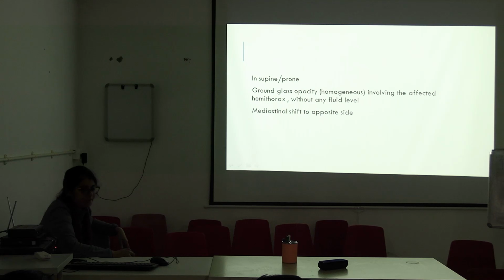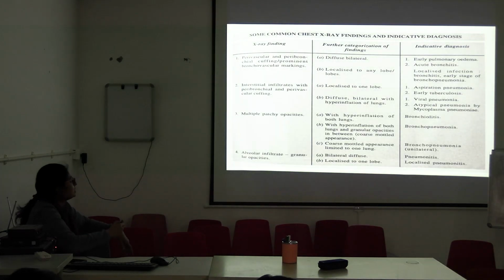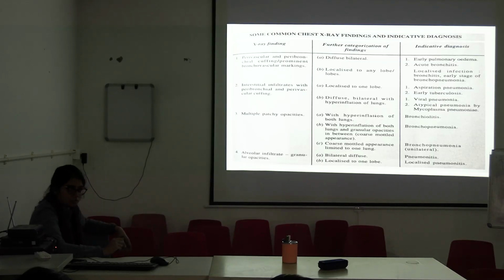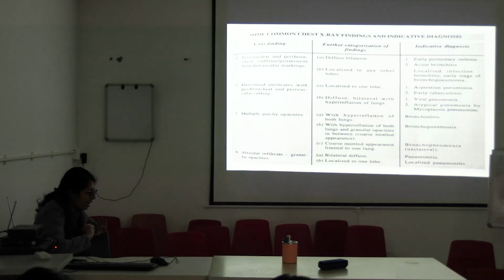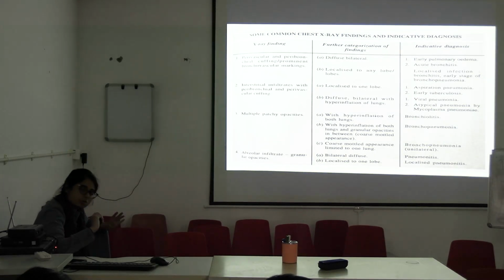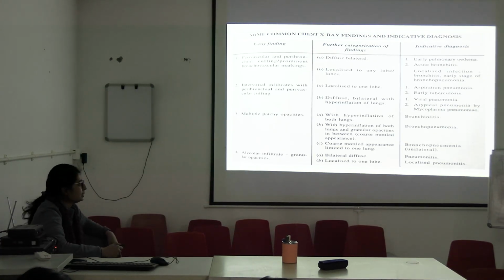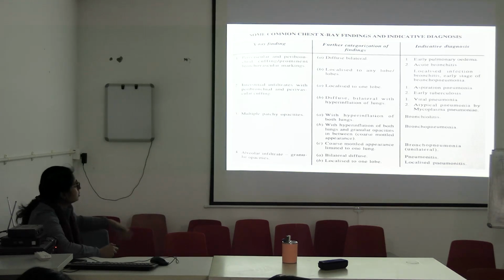You will be given simpler X-rays only, which you will be able to identify. So these are some common chest X-ray findings and indicative diagnoses. I have written everything on the slides from Bedside Clinics by Dr. Shivarjan Ghosh. Nothing from outside, I haven't mentioned anything from any other book. This is totally given in Bedside Clinics by Dr. Shivarjan Ghosh. This table is also found there, but I will try to explain the table to you. So let's see.